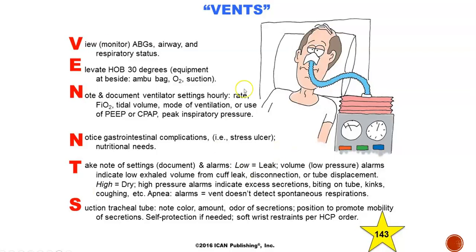Okay, this is just a cute little thing that I saw. So VIEW: we want to monitor airway, ABGs, and respiratory status. E: we want to elevate the head of the bed 30 degrees, and then have our equipment at bedside, our Ambu bag, O2, and our suction.